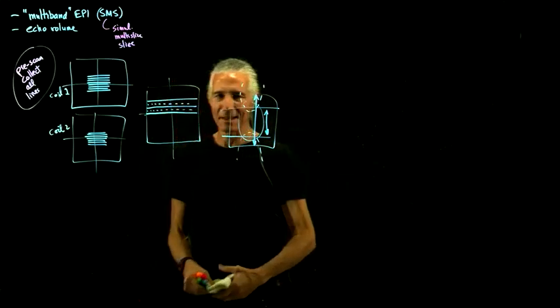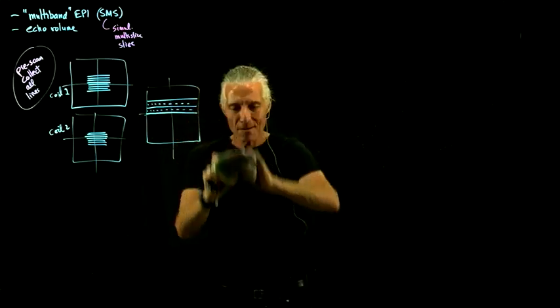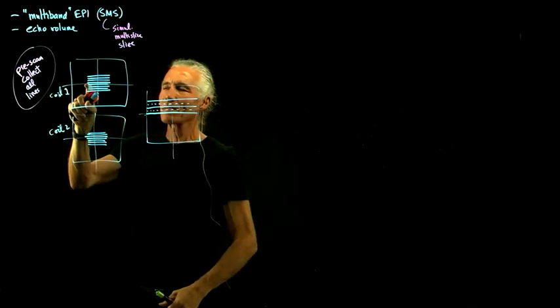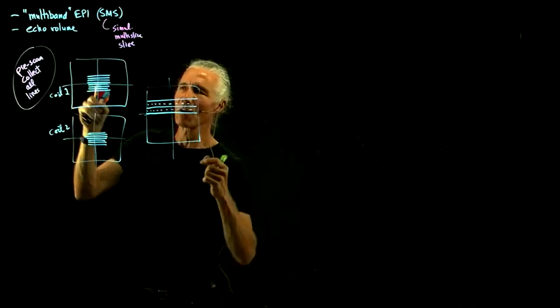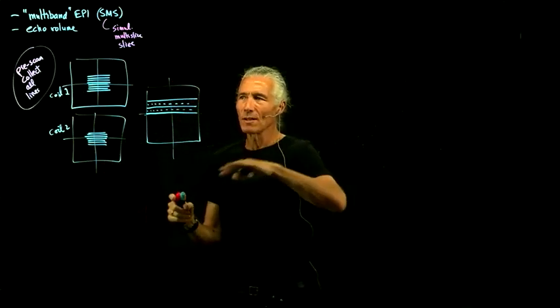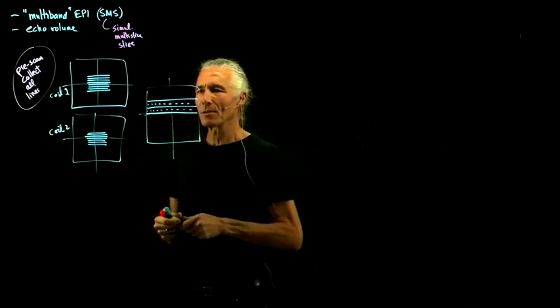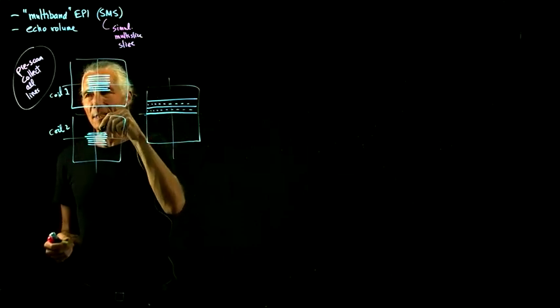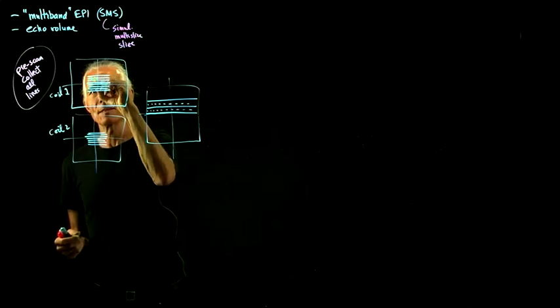So that's not good. That's not going to make a nice picture. But taking advantage of the fact that the information for each spatial frequency in k-space has been smeared because of the coil having this slow fall-off function across real space, what we can do is take this data where we collected all the data and then take a point here and try to predict it from the surrounding points.